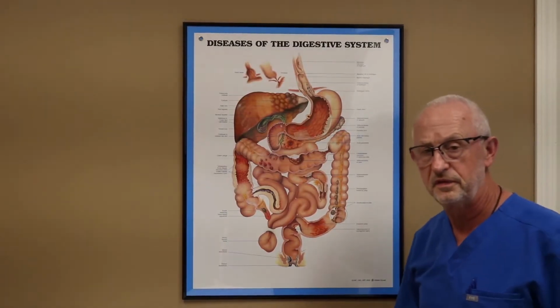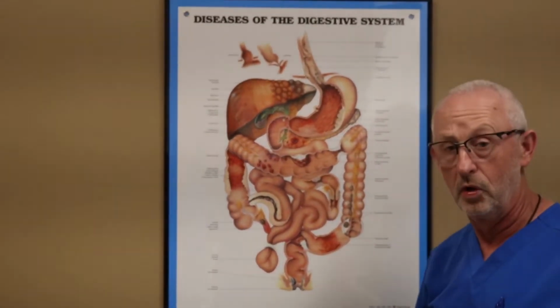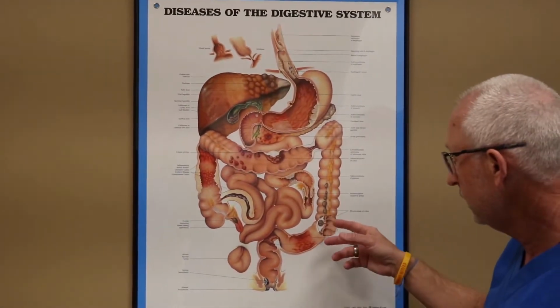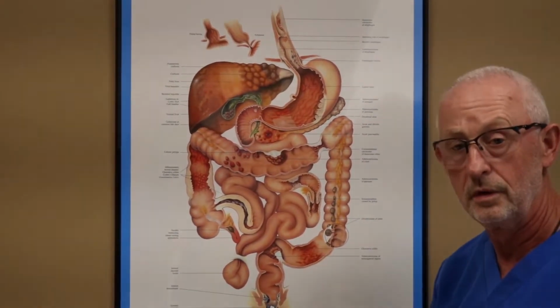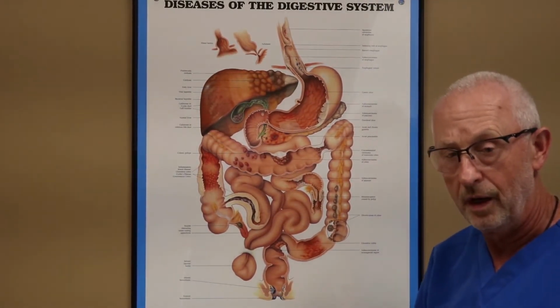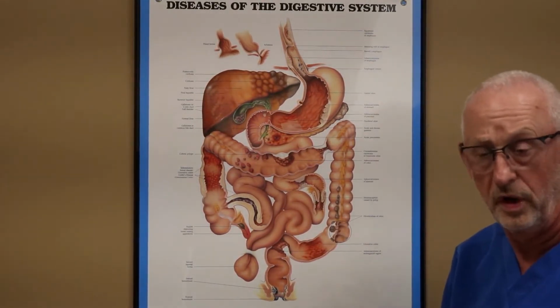An ostomy consists of a connection between the intestinal tract and your abdominal wall. And when we're talking about an ostomy, we are generally talking about a colostomy, which consists of bringing out a piece of the colon to the abdominal wall, where it's anchored, and we put an ostomy appliance or a bag on the skin to collect the stool, gas, and waste.